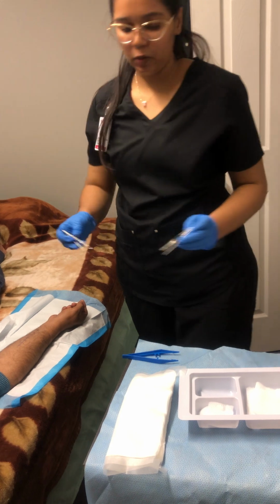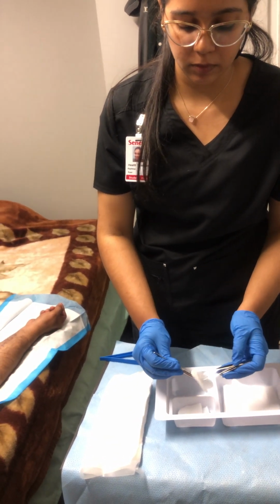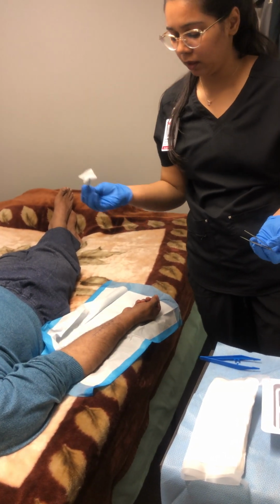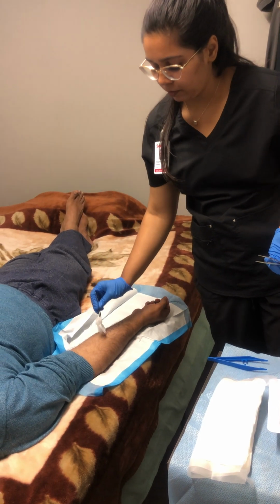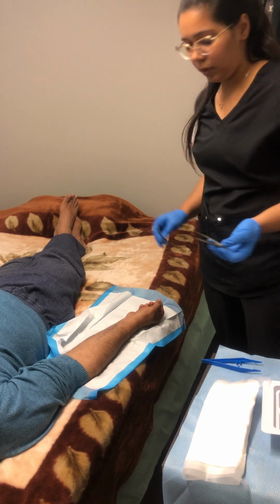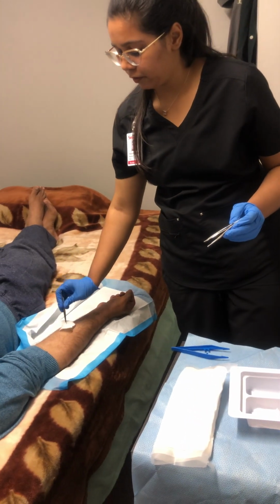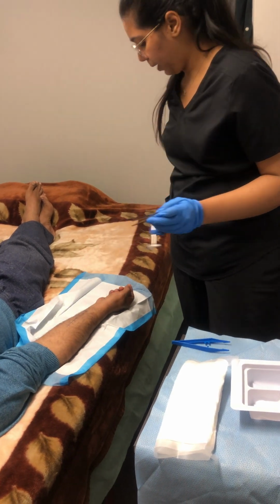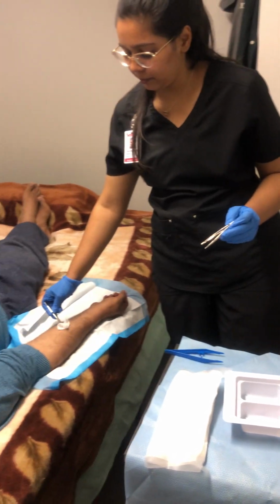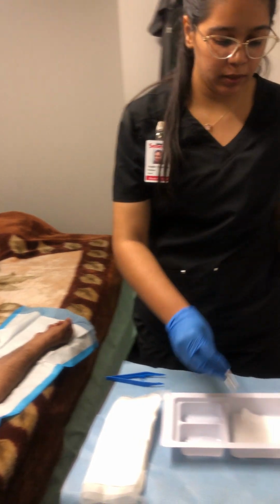After cleaning it, we are going to pad dry it. So we will use the gauze piece. Sorry, I am using the word swab again and again, and it is a gauze piece. We will pad dry it in the middle line. Throw it in the garbage bin. Again, one more. For this side, head to toe, pad dry it. With the last gauze from the nearest end, we will pad dry it from head to toe. Throw it in the garbage bin.